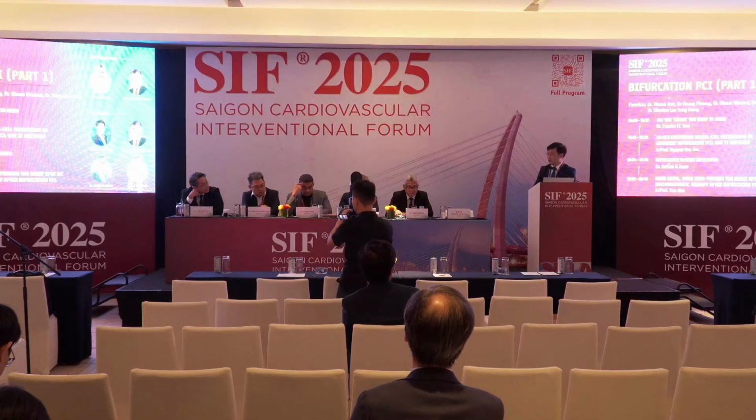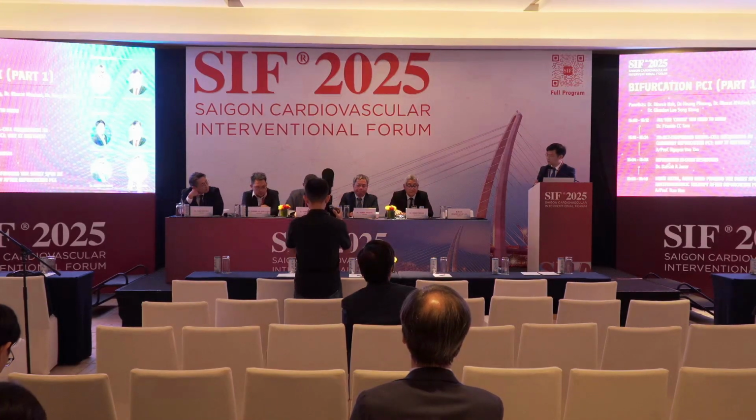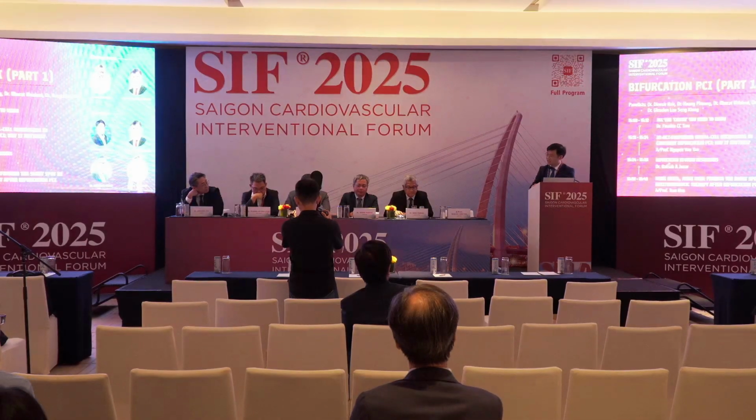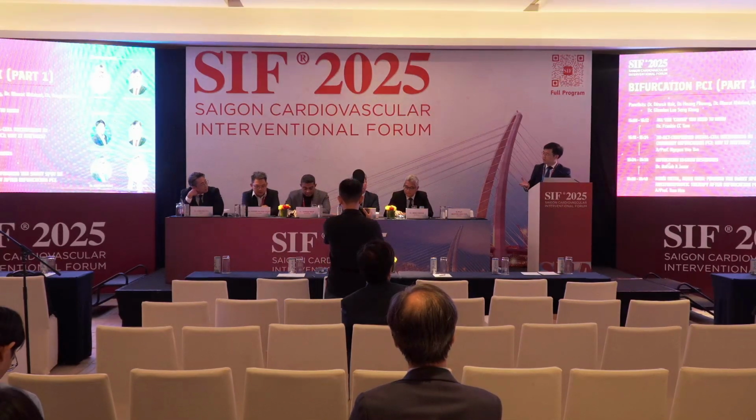In the 3D OCT, we can define exactly whether it is distal or proximal after pre-dilatation, in the side branch or the main branch. Up to now, we have no RCT to confirm that. We need more data. Maybe in the future we will have new data or a new RCT to confirm this about 3D OCT in the distal.